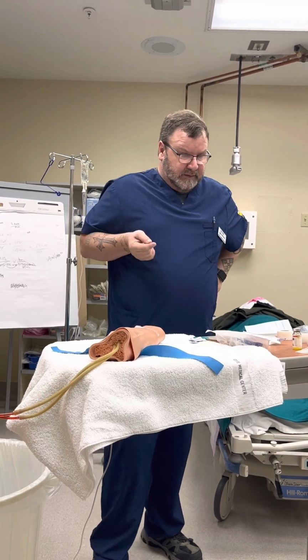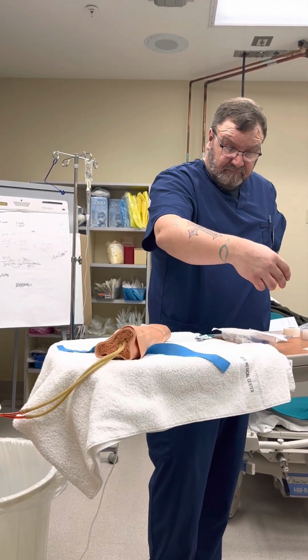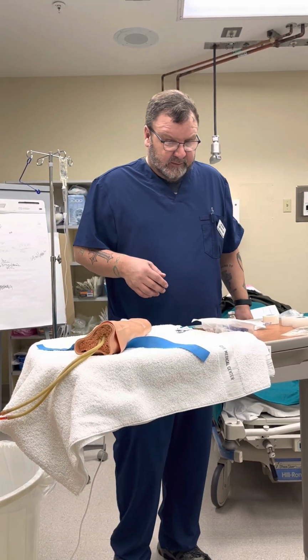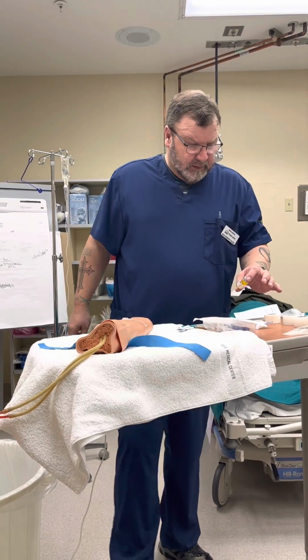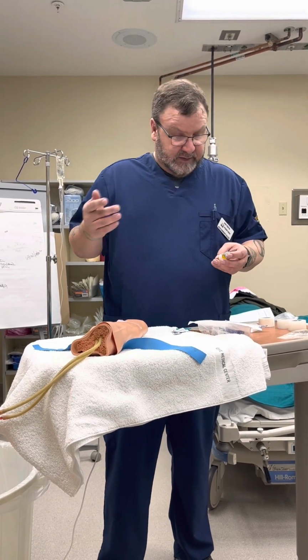Now, for this one, we have an order for claforin for IV needed, and it's by Dr. What was the doctor? I think it was Piggyback, Dr. Piggyback, let's say. So I would do the 3 checks when I'm removing this medication from the drawer, to check my medication against the MAR, and bring it to the bedside.